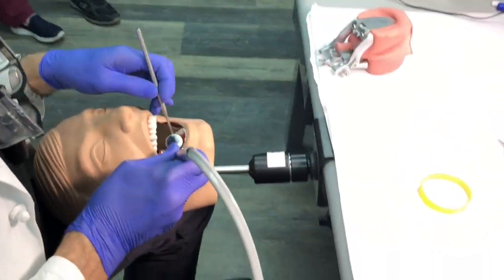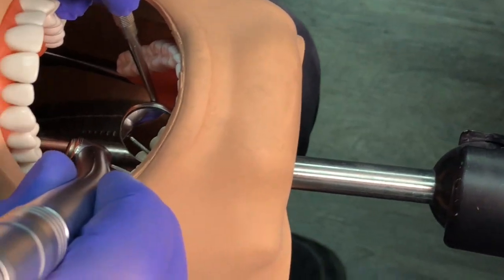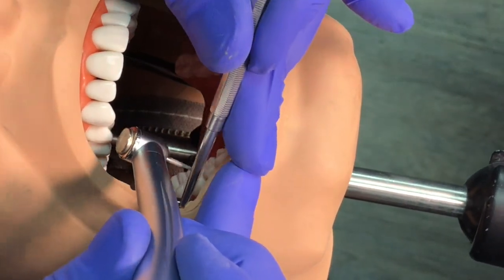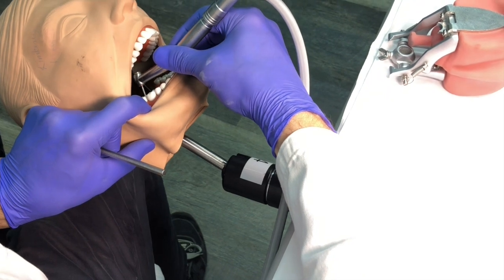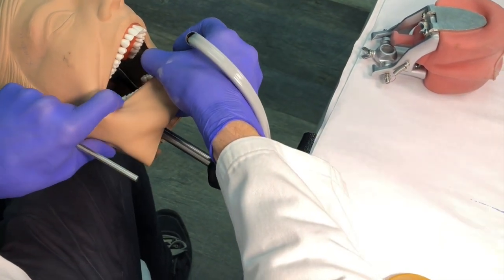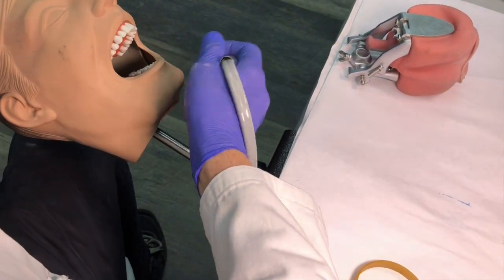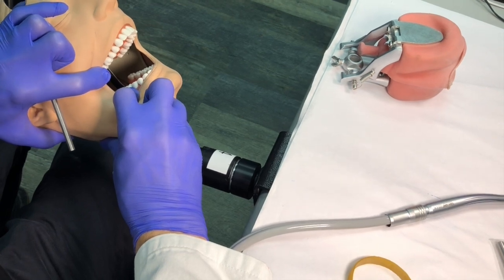I divide and conquer. I'll do a lot of lingual work from 12 o'clock because I can see a lot. I'll come in as close as I can to the interproximal, do as much as possible, then move to seven or nine o'clock. Nine o'clock with the patient slightly up provides amazing direct vision on the mandibular first molar. These mannequin cheeks are as tight as it gets — much more difficult than real patients. With rubber dam on a patient it retracts beautifully, which is another great benefit of rubber dam.